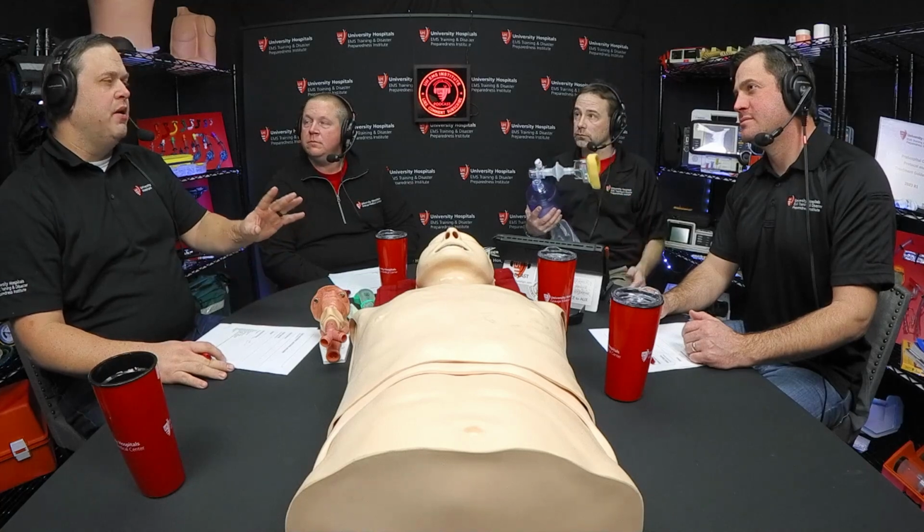But what I want to say about PEEP though is that you have to keep that mask seal the whole time. Absolutely. Because if you take that seal off, you broke the seal, all that built up pressure inside the lungs, which likely is going to be set at 5 centimeters of water, has now come out, and now you have to rebuild it. Yeah, correct. The pressure is always going to be 5, but you're recruiting more alveoli. So the longer the patient has that PEEP, the more alveoli you can recruit.